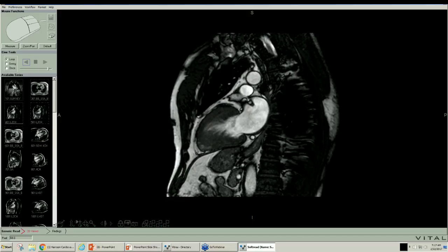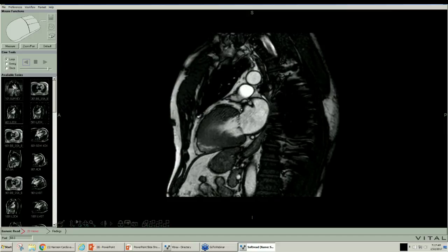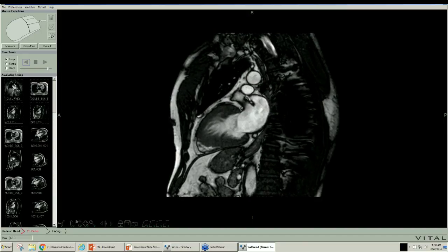And so we've got the apex, we've got the septum, we've got the posterior wall. Every bit of the left ventricle is thickened. Here's the mitral valve. You see a little puff of mitral regurgitation, not much. The left atrial enlargement. We can suppose that there is diastolic dysfunction when you see a ventricle this thick. There's no way it's going to have a normal filling curve.